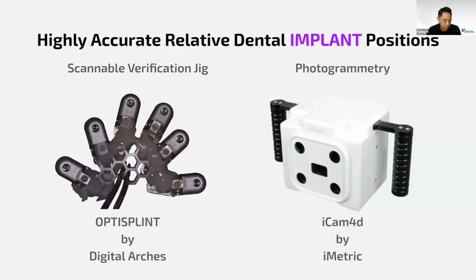So one of the issues that a lot of these other intraoral scanning devices have is they're leaving a lot of human factors on the table. If you're using an intraoral scanner and you're scanning some kind of device intraorally where all of the pieces are touching each other or close to each other, you're still scanning in an environment where there's blood, tissue, saliva. The patient might be moving. So the patient is absolutely one major human factor.